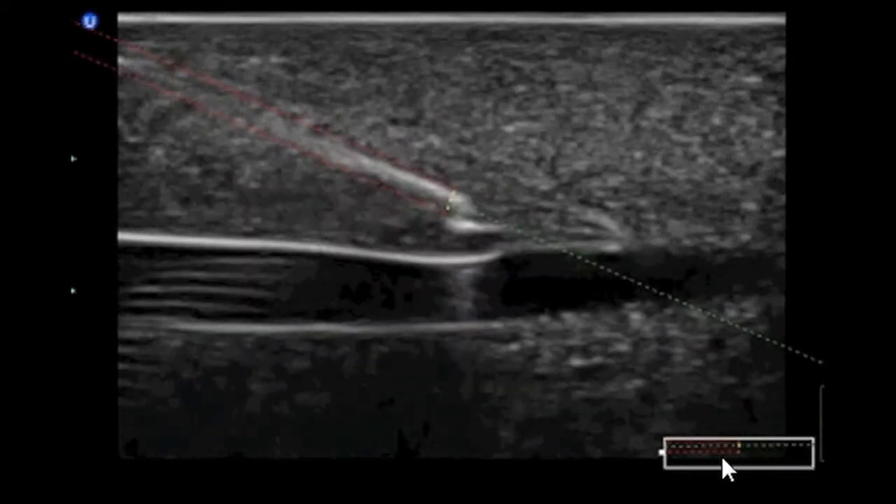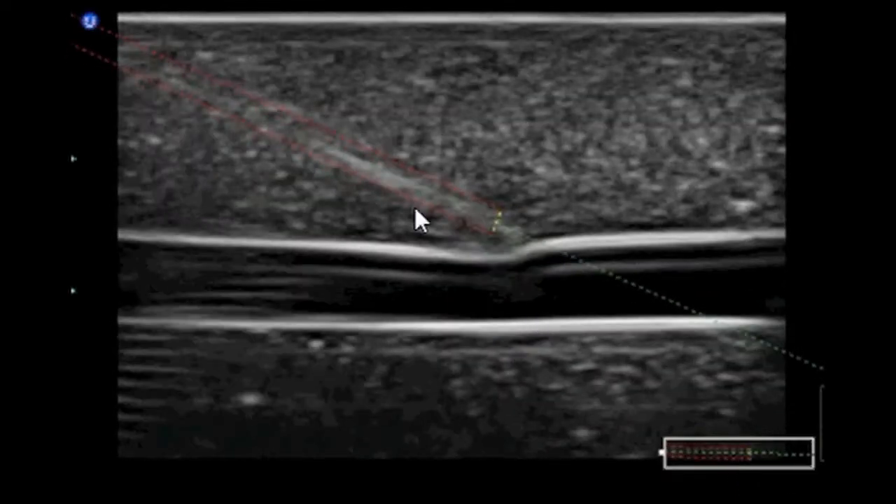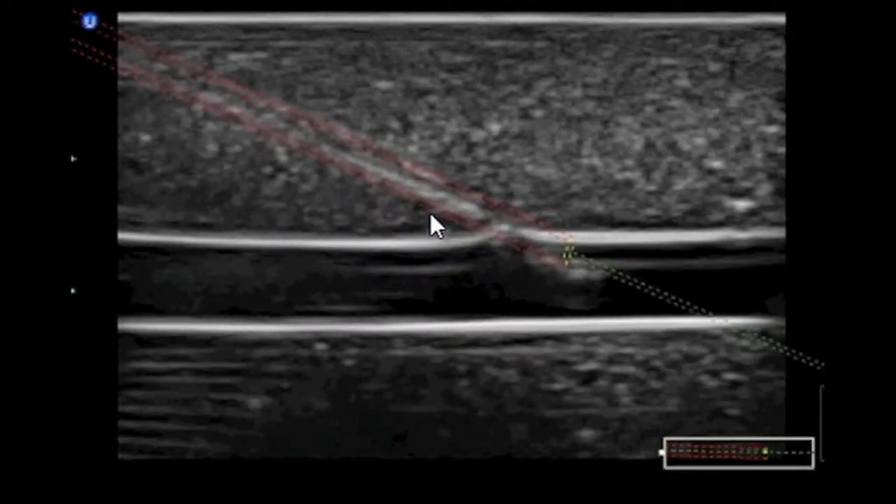Down here is where the transducer sees the needle. You can see we're right in the middle — we get a nice shadow-down effect, and we have the overlay here.